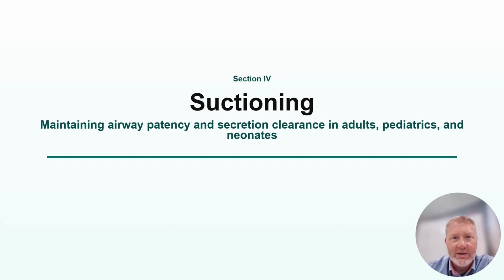The rate that is set for the non-invasive ventilator, so when they're on BiPAP and you set a rate, that is a backup rate. We expect them to be able to breathe at a rate on their own, and that only kicks in when they fall below the setting on the vent, and we'll get into that down the road.